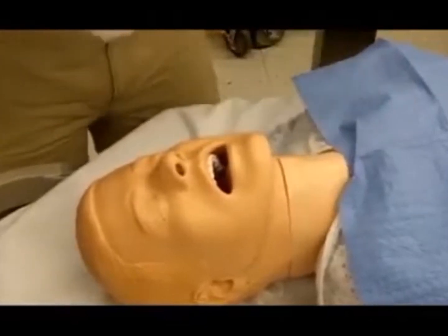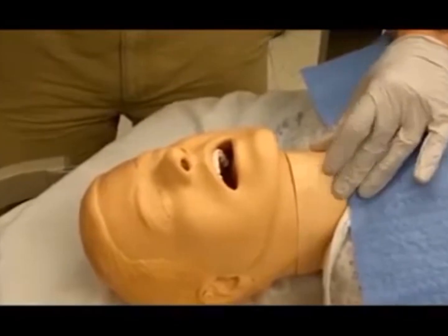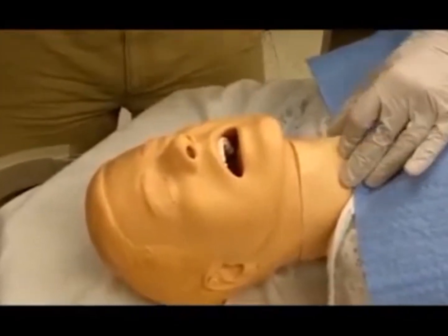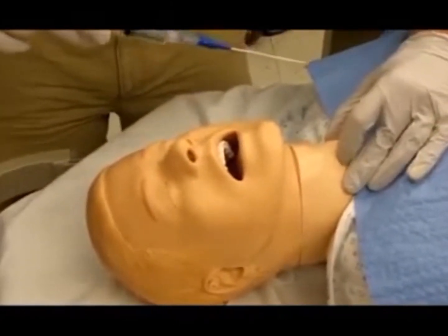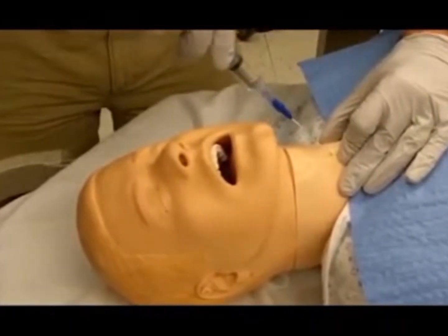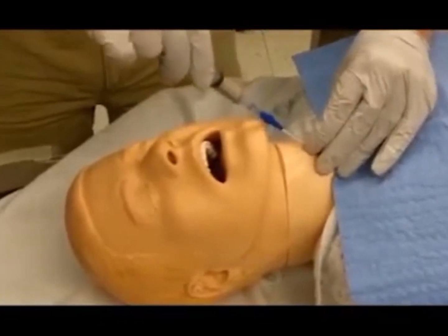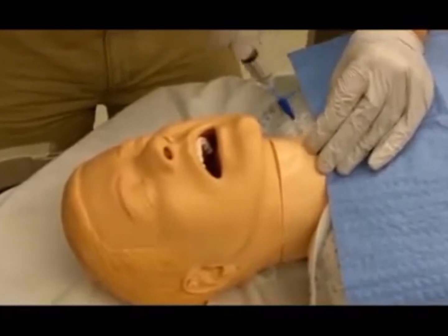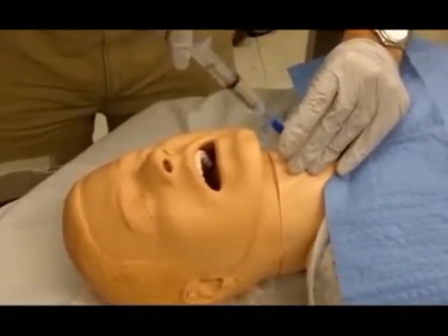Immobilize the larynx with the thumb and middle fingers of the non-dominant hand while palpating the cricothyroid membrane with the dominant index finger. Insert the transtracheal needle into the cricothyroid membrane at about a 30-degree caudal angle while withdrawing the syringe to look for air bubbles. Air bubbles within the syringe upon aspiration confirm passage into the trachea.